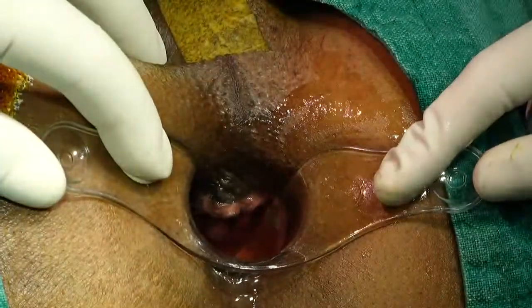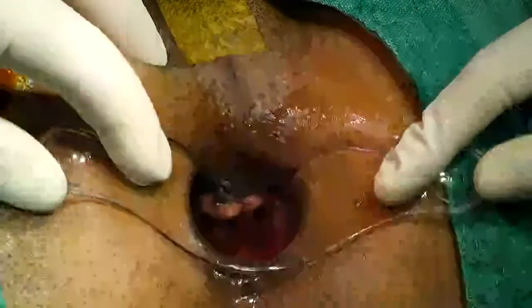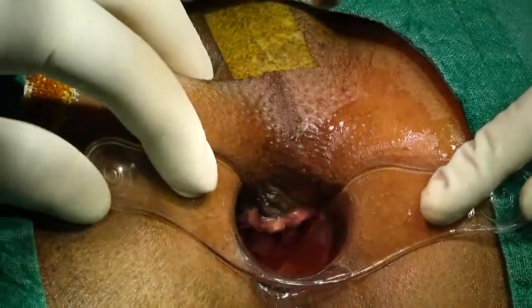So we have to target this. But Dr. Chipte has mentioned two layer repairs, and HAL is a one layer repair. Not exactly one layer, just targeting the vessels, the hemorrhoidal artery at 3, 7 and 11 o'clock positions. So one is finished.